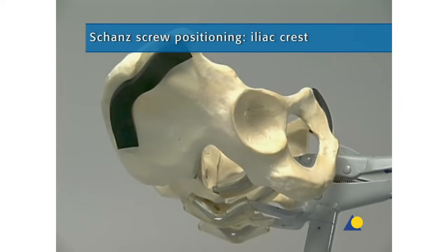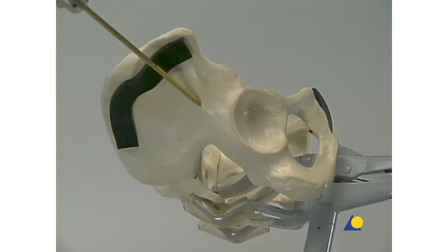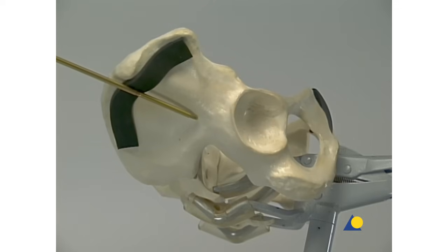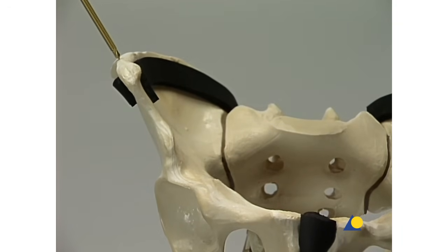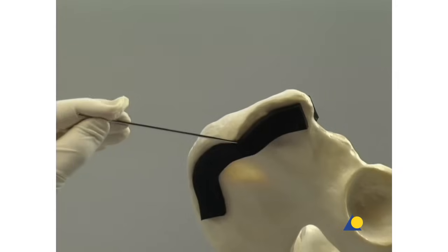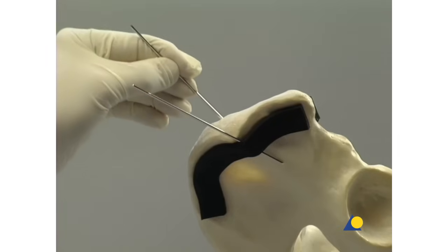Positioning of the Schantz screws in the iliac crest is now shown. The anterior edge of the superior anterior iliac spine must first be determined. From the tubercle of the iliac border, which lies about four centimeters dorsal to the superior anterior iliac spine, a strong rim runs obliquely in the ventral direction; however, this direction is not suitable for anchorage of the Schantz screws. Although it is easy to find an insertion point in the broad iliac crest, a secure hold is difficult in the thin wall of the ilium. The inner and outer surfaces can be marked with K-wires to help determine the direction.